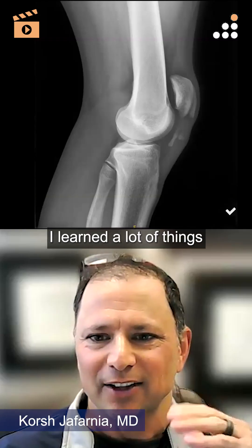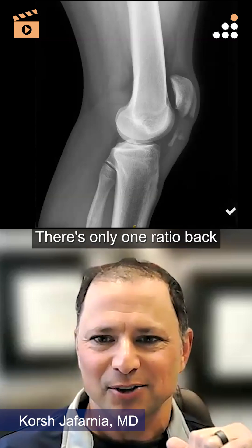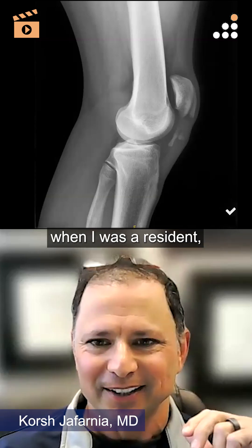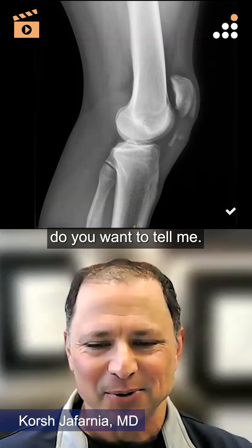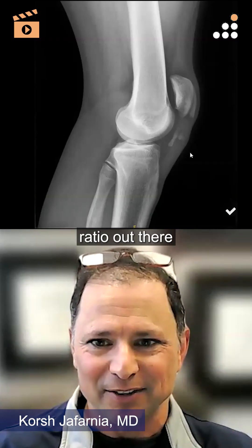Just in preparing for this case, I learned a lot of things about these new ratios. There was only one ratio back when I was a resident — I won't say how long ago that was — but now there are two or three more new ratios. Do you want to tell me which was your favorite ratio for measurement of patella alta or baja?